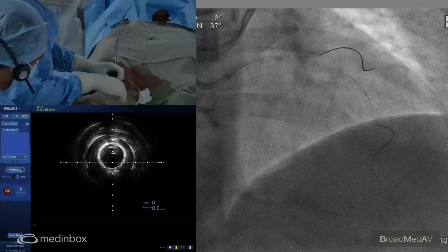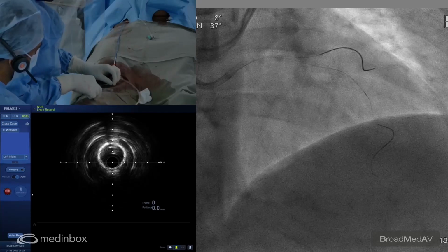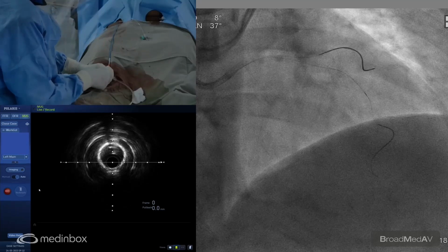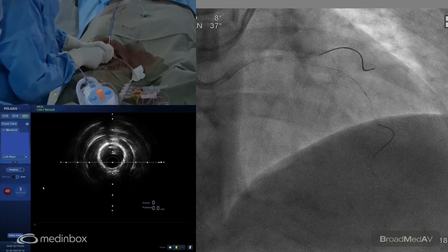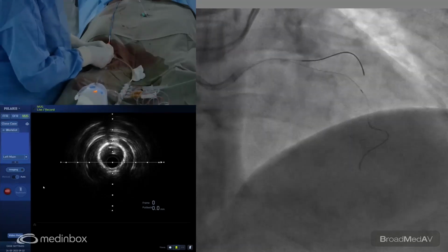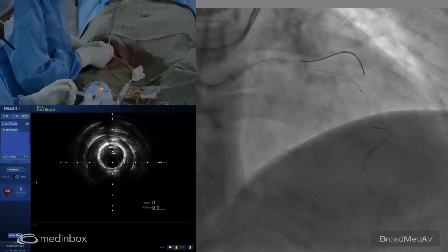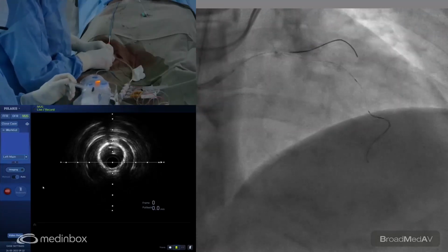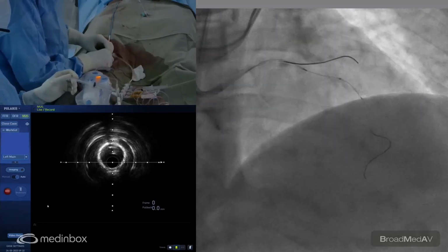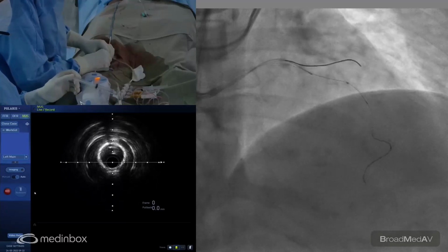Even if there is no aorto-ostial lesion, I personally prefer IVUS as a better imaging modality than OCT, because the choice of the lithotripsy balloon sizing is going to be made by the vessel size. The EEM we are going to see only in the IVUS, definitely not in the OCT. So at the site of the block, if it is negatively remodeled, the vessel size is small, or if it is positively remodeled, the vessel size is big. So IVUS is going to give a clear picture rather than OCT.